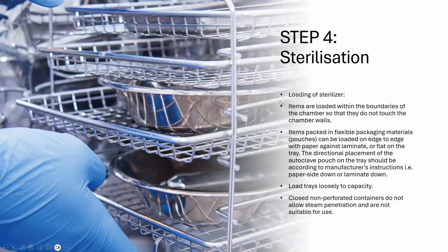Step 4, we are discussing sterilization. Sterilization items are loaded within the boundaries of the chamber so that they are not touching the chamber's wall. Items packed in flexible packaging materials, in pouches, can be loaded edge to edge with paper against the laminate, or flat on the tray. The directional placement of the autoclave pouch on the tray should be according to the manufacturer's instructions, that is, paper side down or laminate down. Follow the manufacturer's instructions of both the autoclave and the pouch manufacturer.